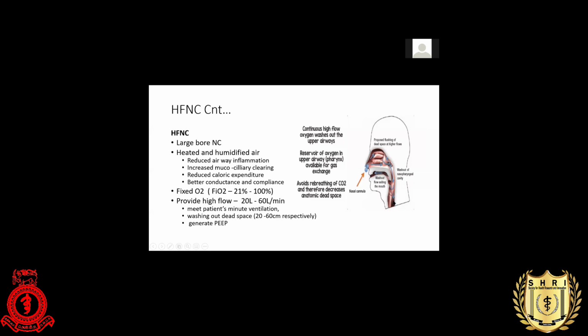And the other thing is, because of the continuous flow, if the patient's mouth is closed, it will create a positive airway pressure in this passage, right? So it acts as a PEEP. Not like you can generate with a ventilator, but it can generate a small amount of PEEP, and it helps to keep your airway open.